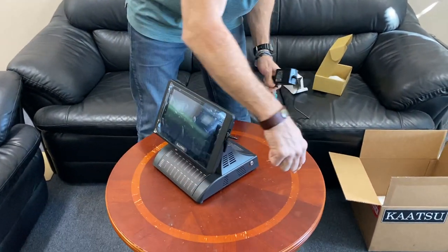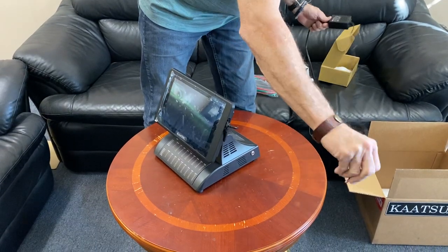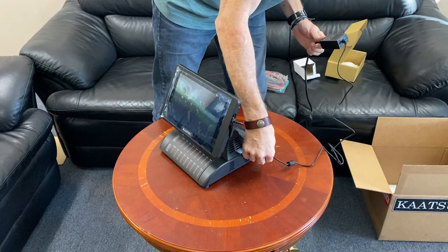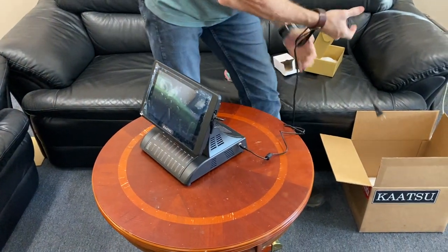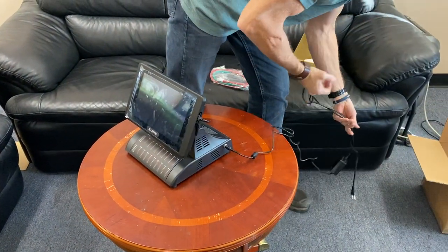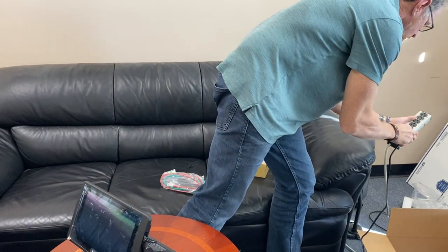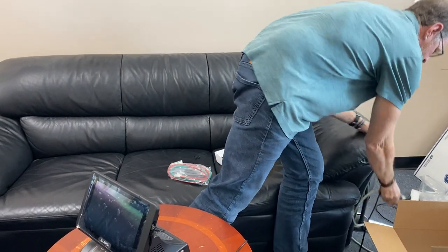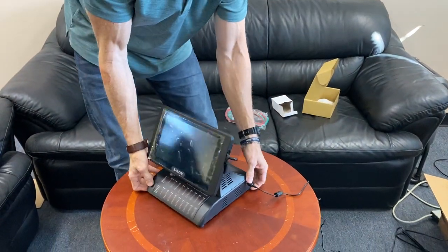On the right side of the device, you'll see a metal female connector. Take the male connector of the power cord and plug it in right there, then plug the other end into the wall or a power strip. Now you have power to the device.